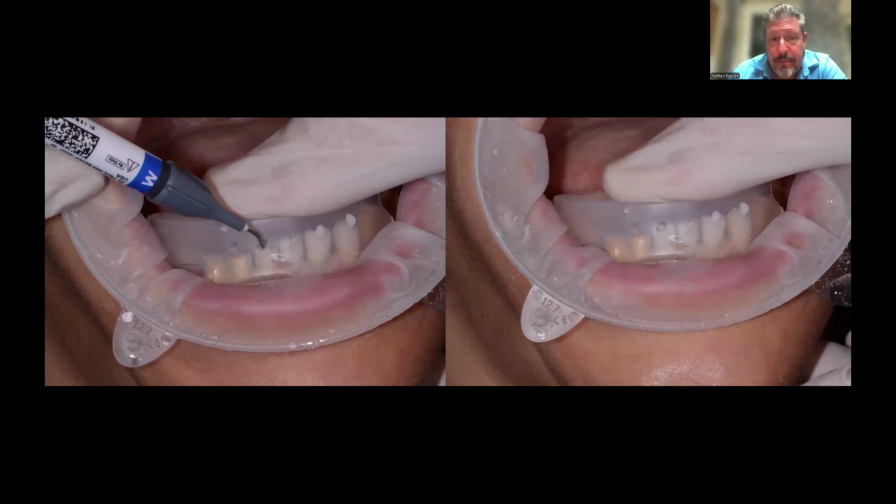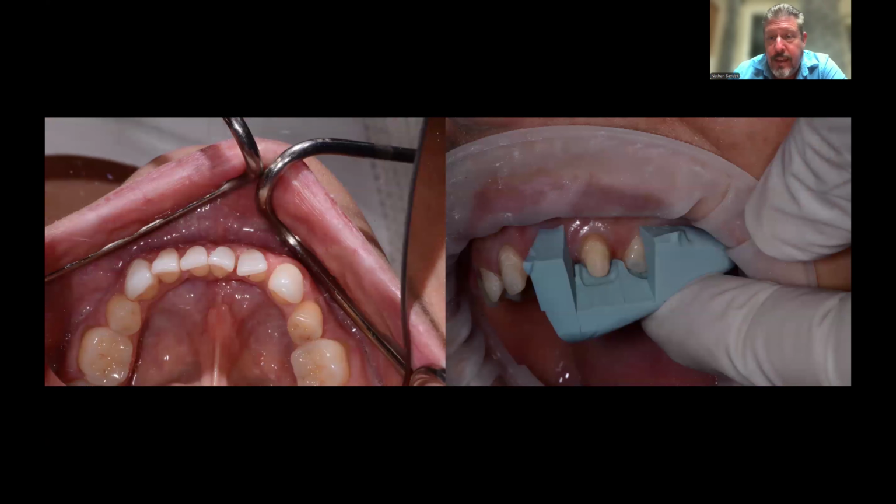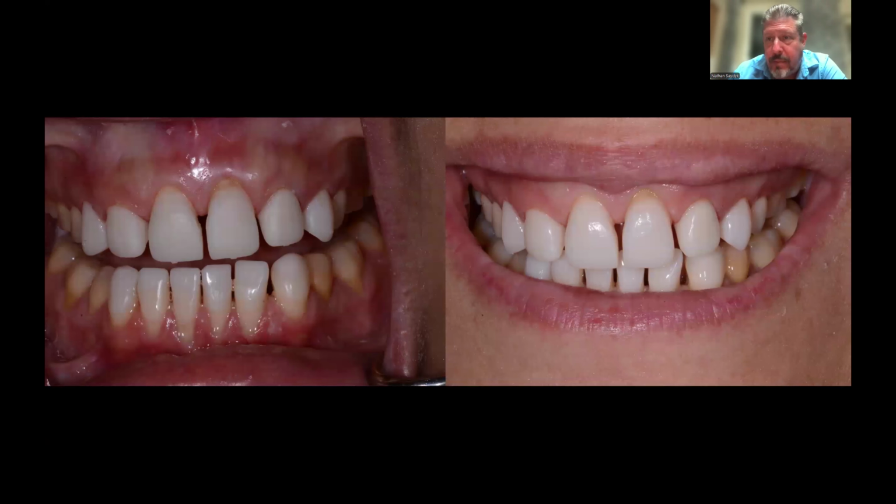And we waxed them up and we put them in the wrong position because that's where they were, but we gave her whole teeth. For the uppers, I cut the crowns off and we made sure we had appropriately shaped 3D printed crowns and bonded them on. And we can now reshape these as time goes on too. We made them the proper width and the proper height. She's going to have some gum surgery to cover some of this stuff up, and we're doing ortho.